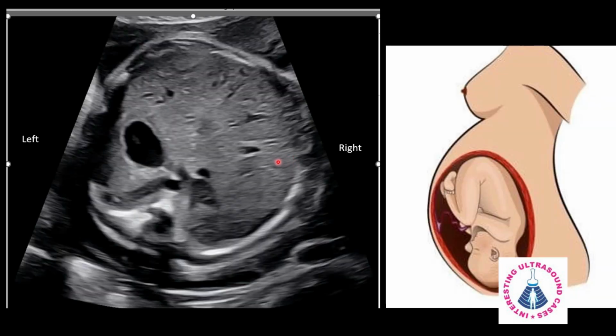In this video, we shall see about the basics of fetal echo. The first thing in fetal echo is we have to determine the situs. The easiest way to determine the situs is imagining ourselves in the fetal position. Here, the fetus is in cephalic presentation.